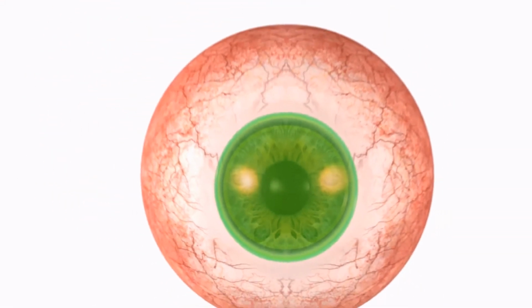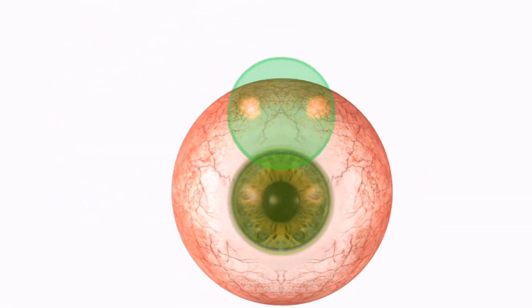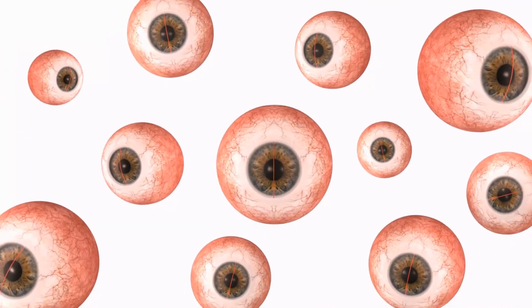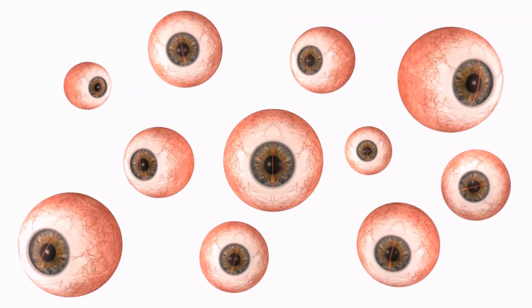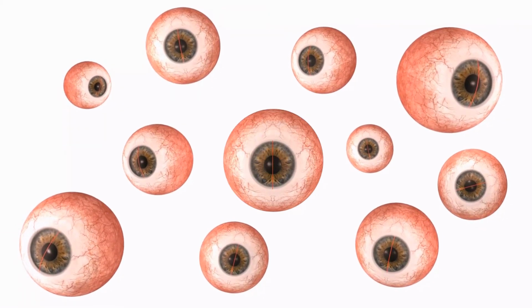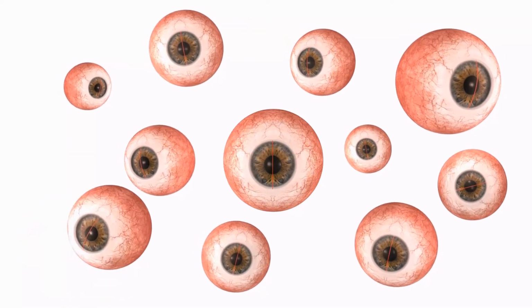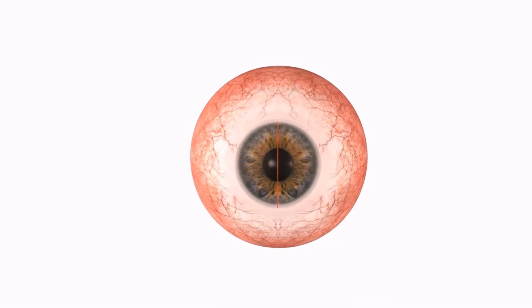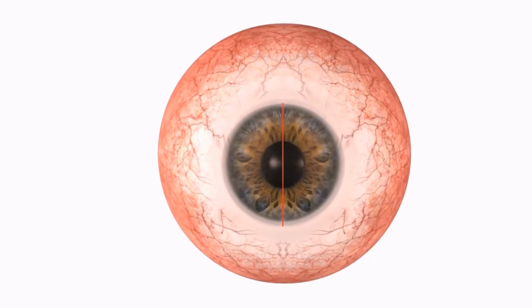This optical principle of adding the two surfaces together forms the basis of nomogram adjustment of anterior keratometry and also underpins calculators which take into account unmeasured posterior corneal astigmatism. We have developed population average statistics based on measurements of posterior corneal astigmatism in many thousands of eyes. We have a good estimate of the magnitude of posterior corneal astigmatism, and also that its steep axis is most usually orientated vertically, although it can be oblique or horizontal.